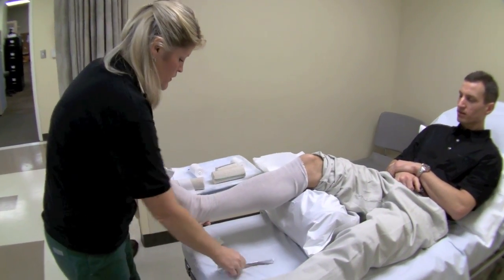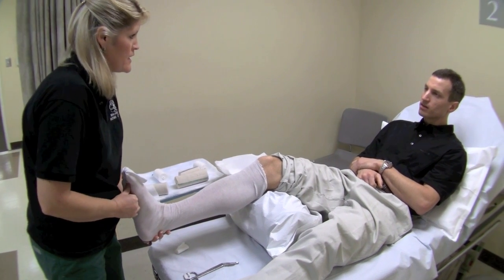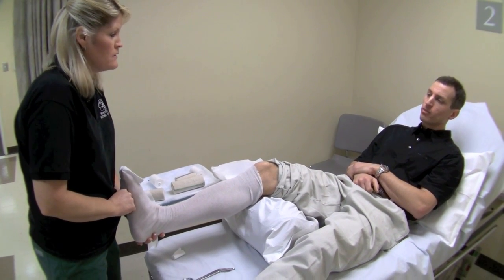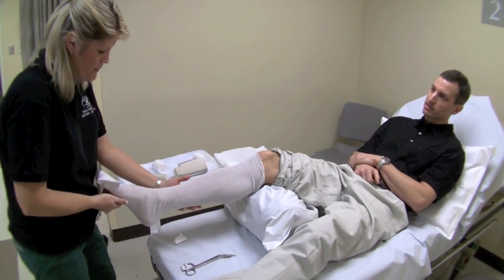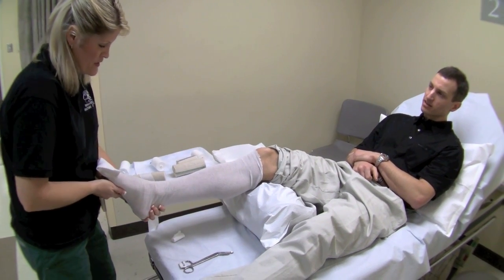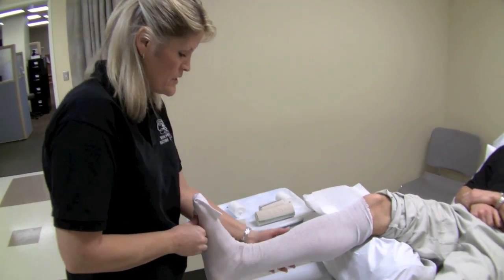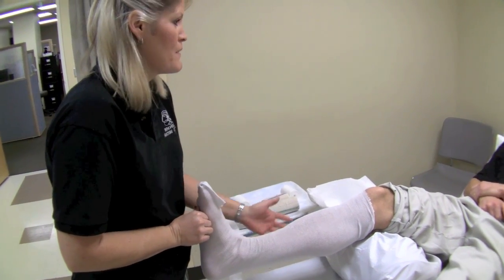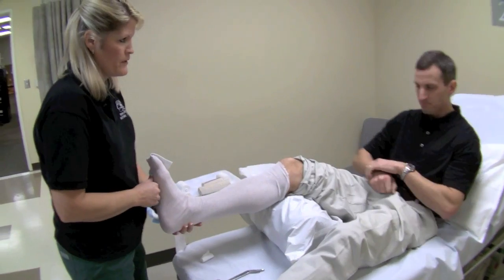It's really important to bring the foot up — we want to get a 90-degree angle. Pearl number two: 90 degrees. What would happen if we kept it in plantar flexion? You get really stiff, and when you come back in a few days, we'd have to bring you back up to 90 degrees. So this 90-degree angle is key for the splint.